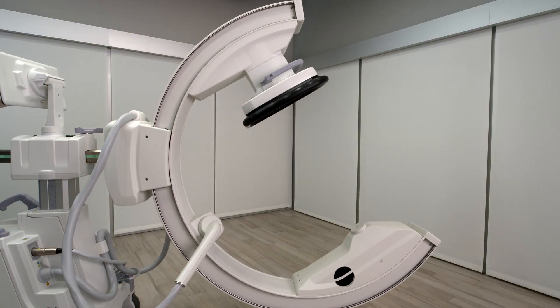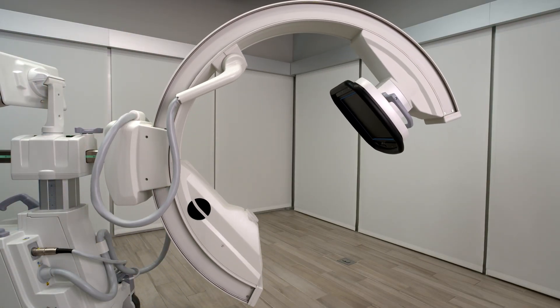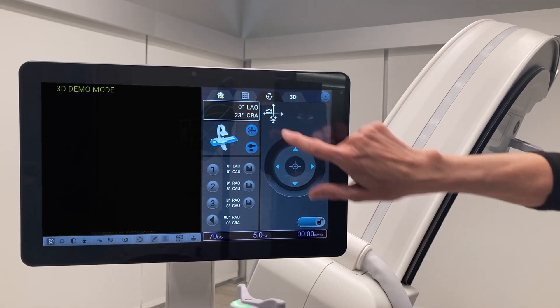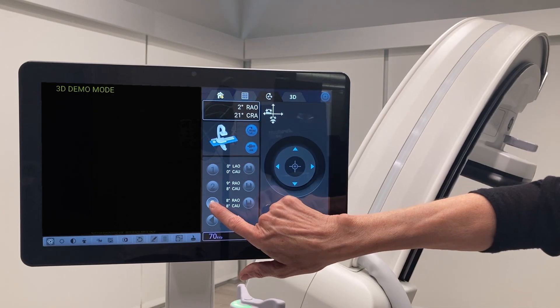The OEC now allows us to do that real-time in the operating room. The image quality is top-notch — you can see everything on this that you can on a regular CT scan. Being able to save multiple positions makes it easier for our techs and for the surgeons, where once we've found ideal imaging for placing implants percutaneously, especially around the pelvis, it's helpful to have those positions stored. Being able to zoom in on the image without magnifying is a feature that helps lower our radiation exposure to patients.